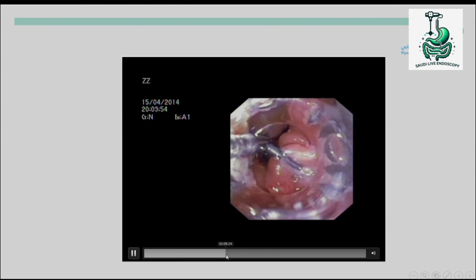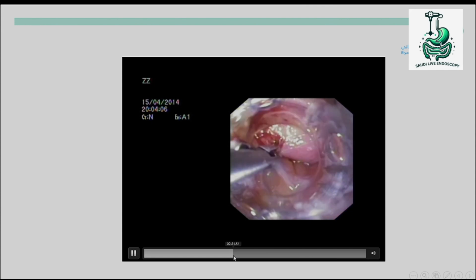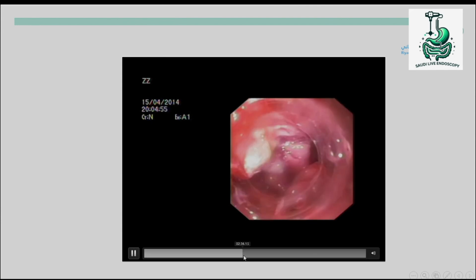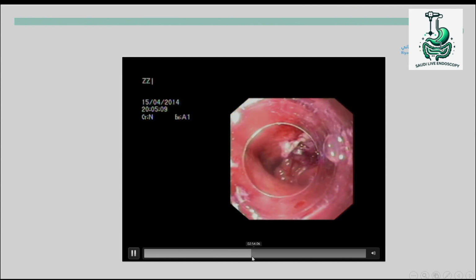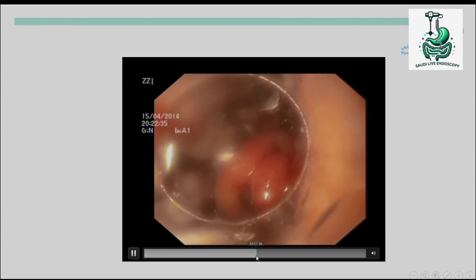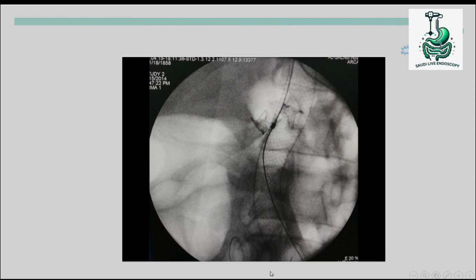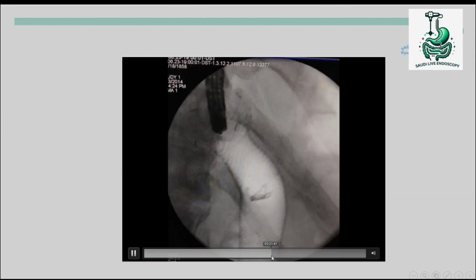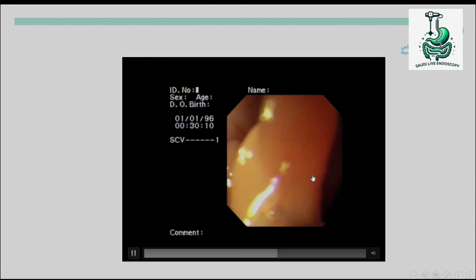just to approximate. Of course, it's not easy with the fibrotic tissues. Eventually we put one clip, and then we put another clip beside it. We know very well they just hold for maybe a few days and then they fall back. Then we put this large mega stent, and you see the clips inside. We followed this patient after several weeks. After 8 weeks, we have this view. The clips, of course, have fallen out, but we're starting to have a proper anatomy.